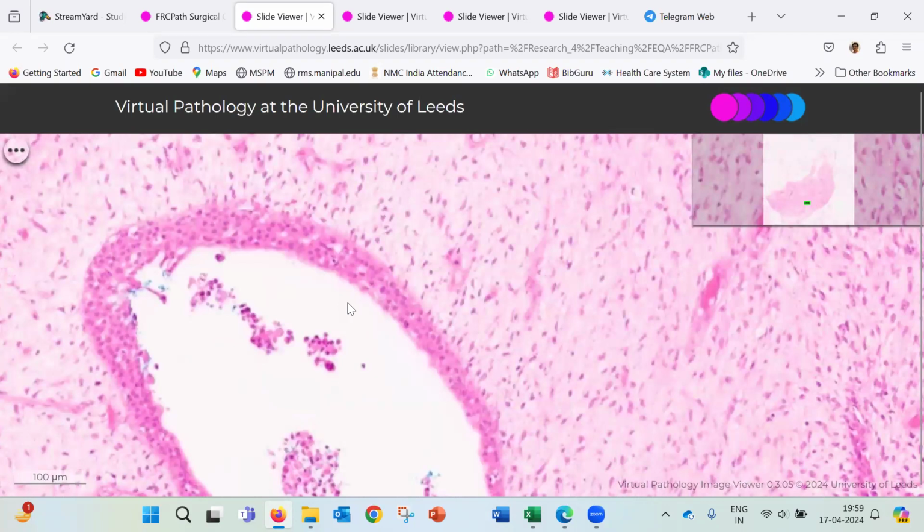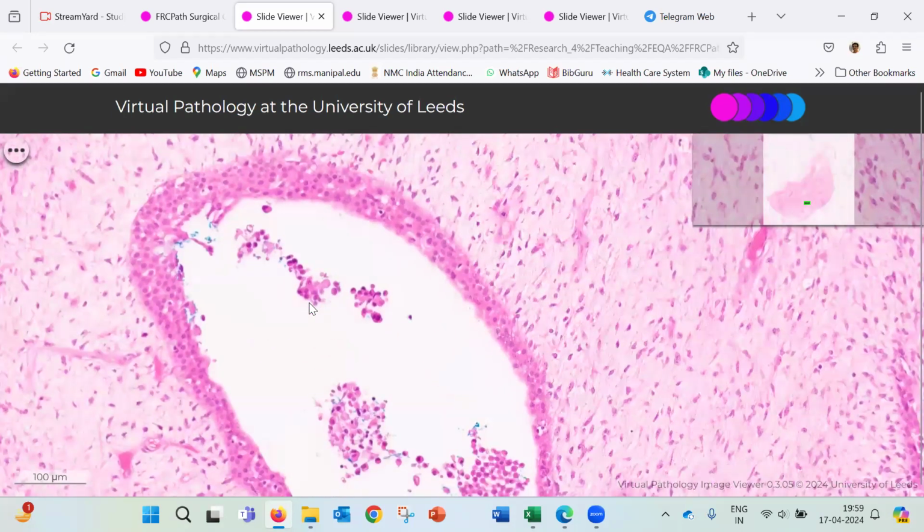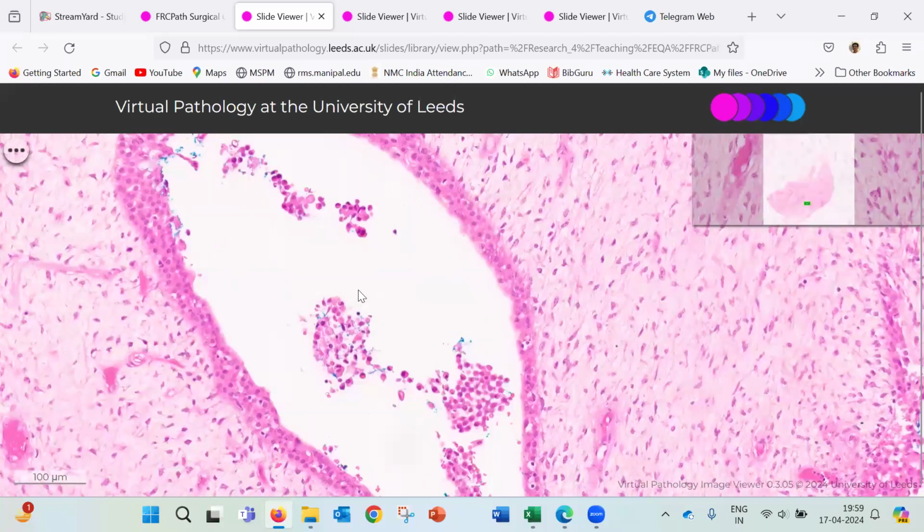If you go by the comment that is given on the Leeds website, you can suggest a possibility of epithelial hyperplasia even up to a degree of low grade DCIS or ADH, particularly for this case, that is acceptable, because you know that fibroepithelial lesions usually have an epithelial hyperplasia also, but it is not up to the range of intermediate or high grade DCIS or the like.